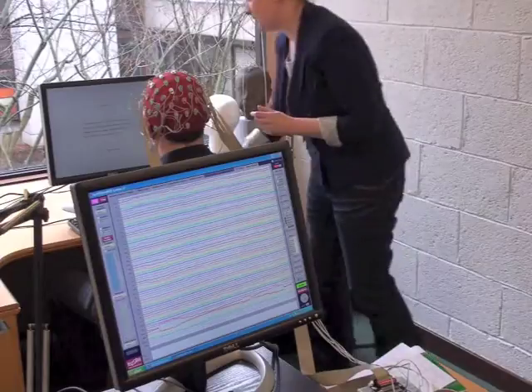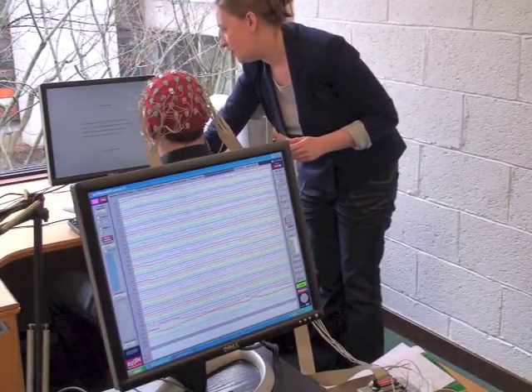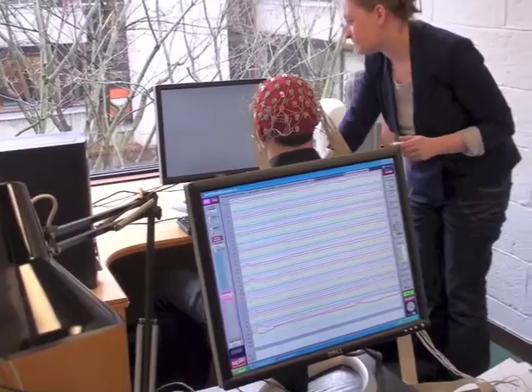Okay, so sorry, Bren. You're very patient. I'm going to start the experiment here for Bren.